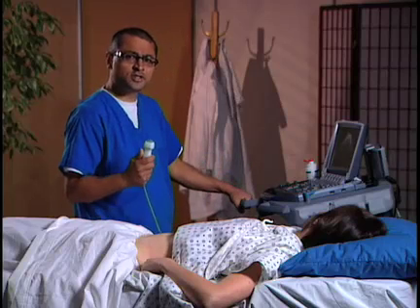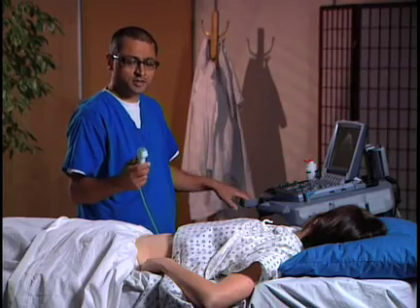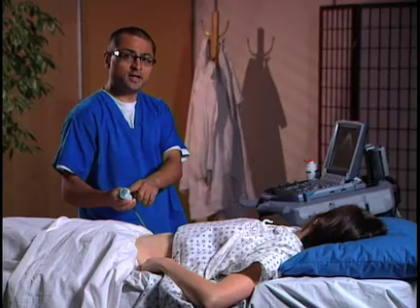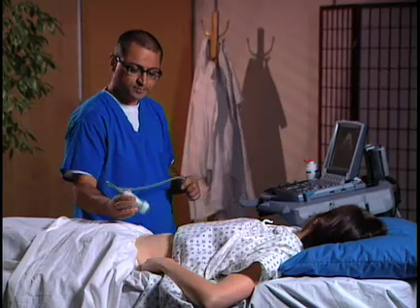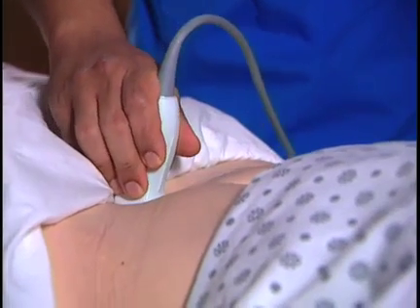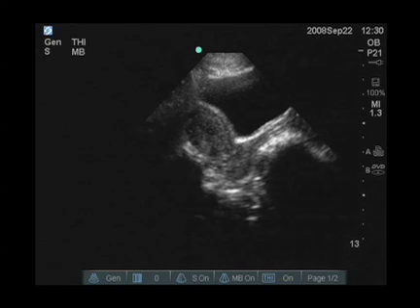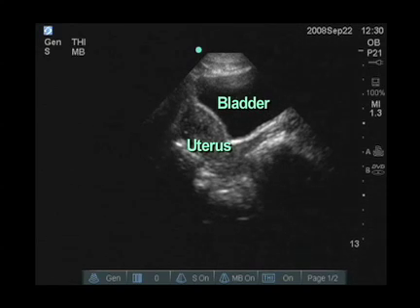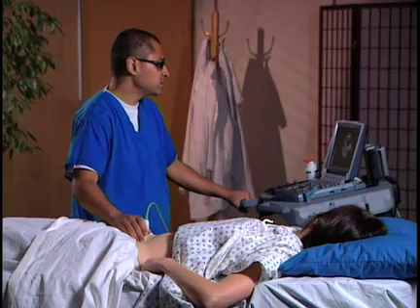The first area that I'm going to scan will be a sagittal view of the pelvis. The probe marker is right here and I'm going to aim that toward the patient's head and place it just above the symphysis pubis. Ideally the bladder is full — if the bladder is full, we should be able to get a good view of the uterus, which will be the key area we're going to interrogate and look for early signs of an intrauterine pregnancy.